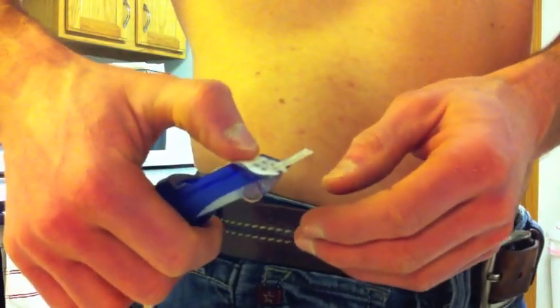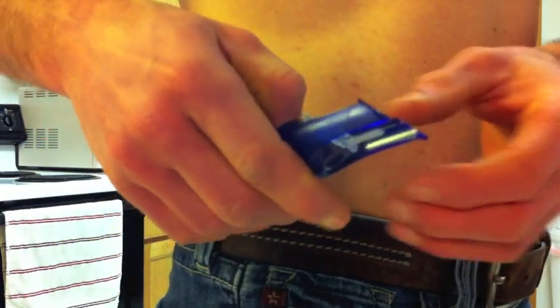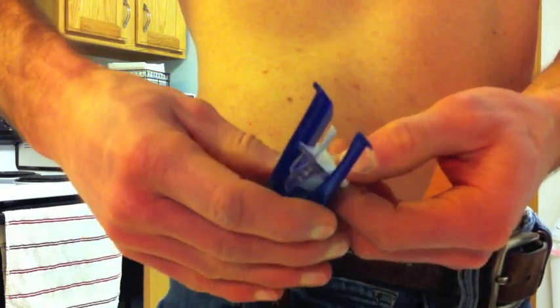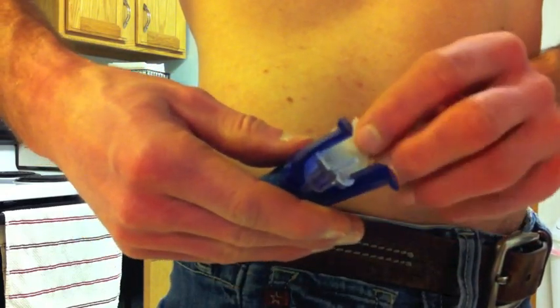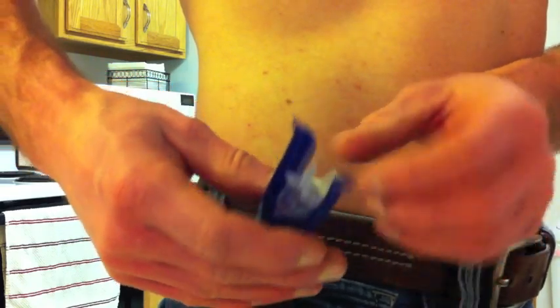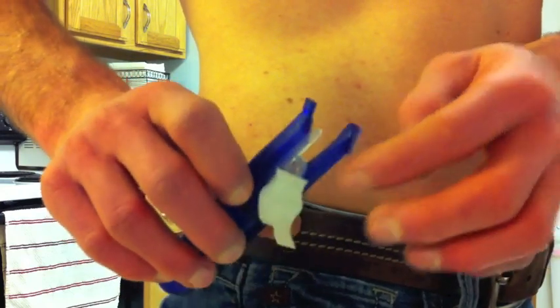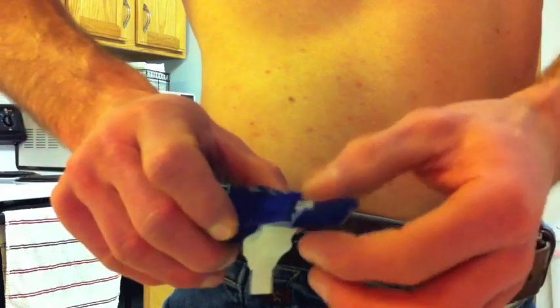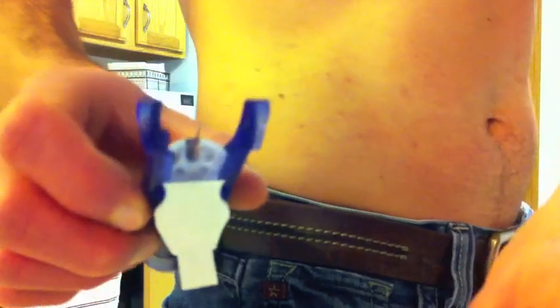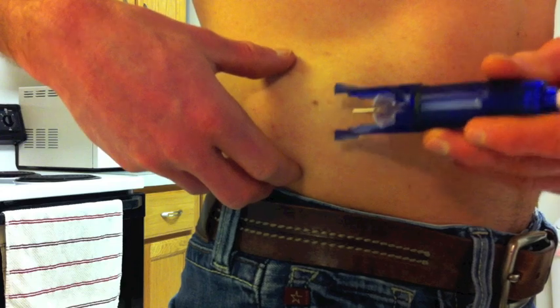Now I need to cock the inserter device, and I leave the needle protector on while I do that, and kind of set up the tape part so that it doesn't get caught when I insert. Now I'll take the needle protector off.